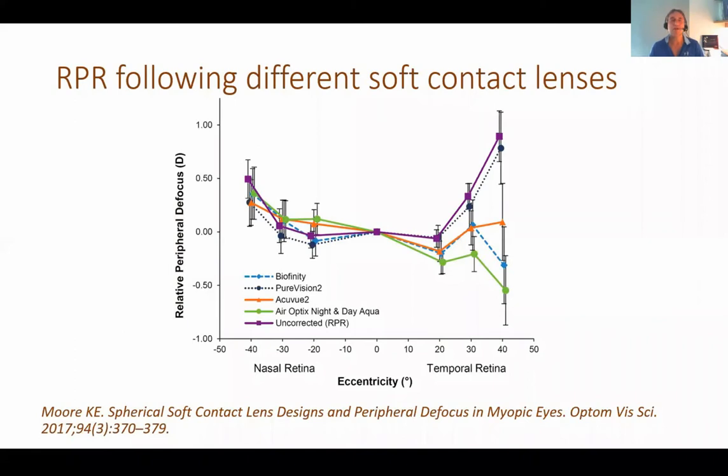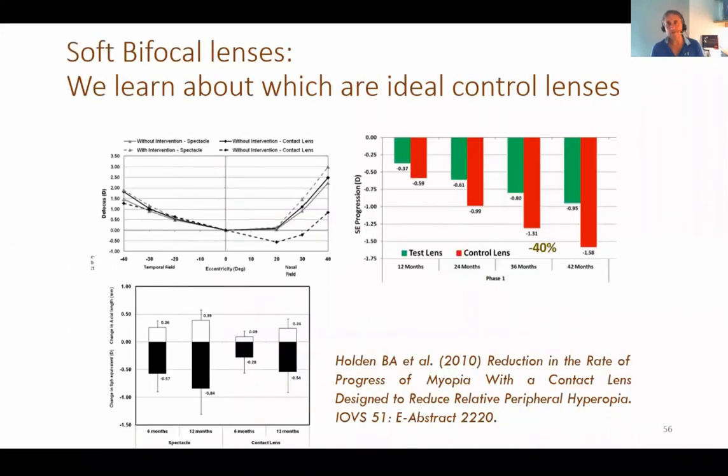It's something. And there is a study, a study that was not randomized, and we can have some idea, it's not a perfect study, that shows us that this kind of lens could control myopia around 15%. So you know already which lens they use in the control lens. In the control lens, they use a Night and Day lens that already makes some slowdown in myopia.